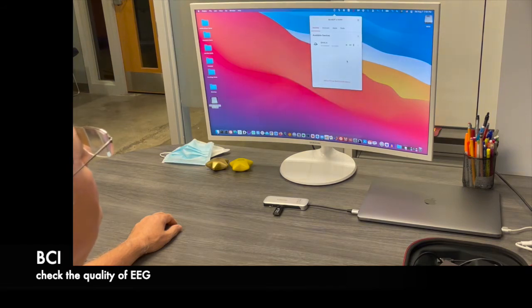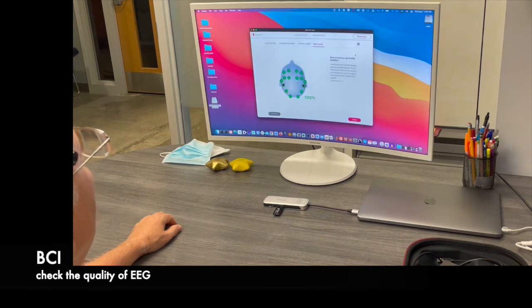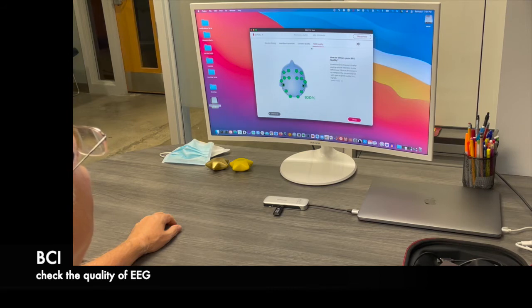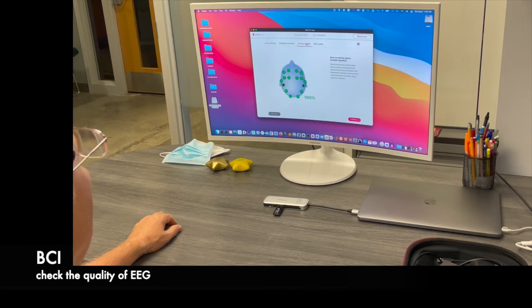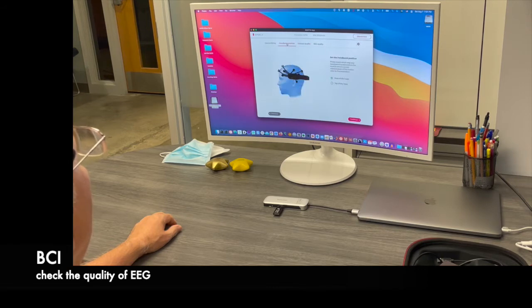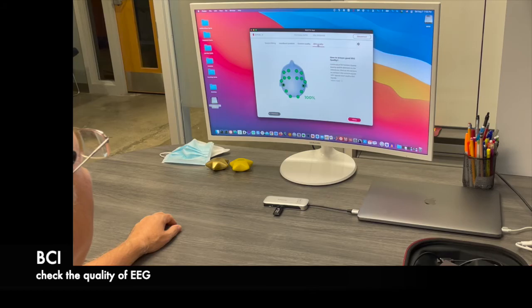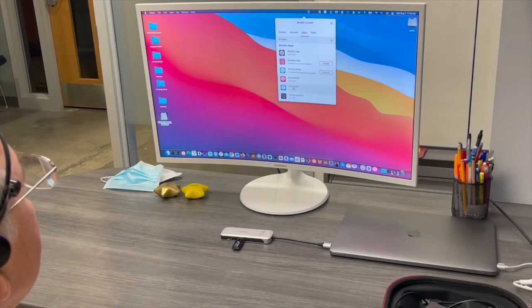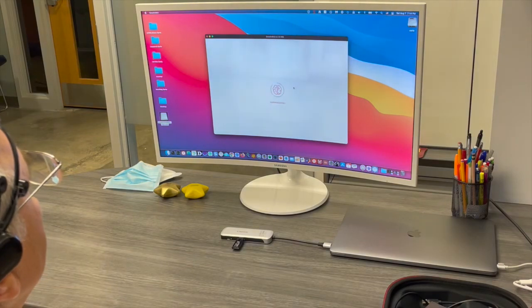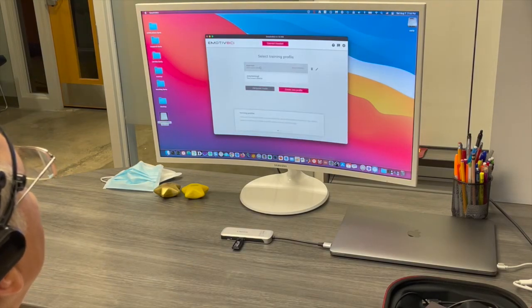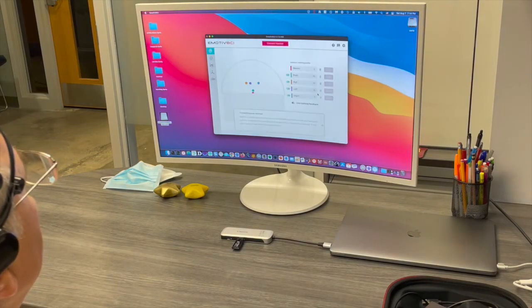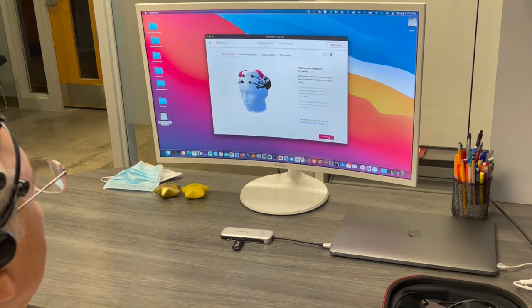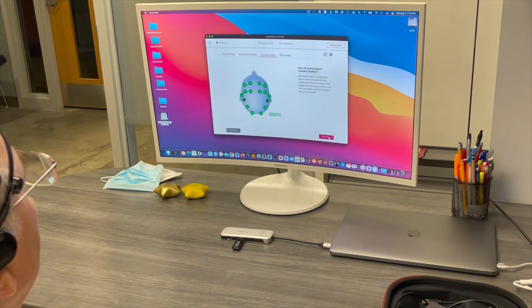Now, once you have it at 100 percent, then you're satisfied with both the EEG quality and the signal quality there, then you can proceed with your brain computer interface. And I selected now the brain computer interface and I have an account already created with eMotive. We already went through the checking of the device.